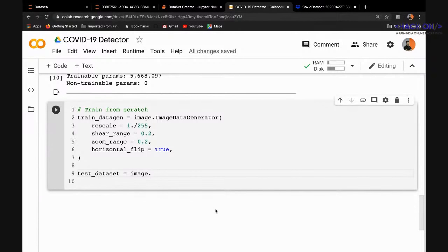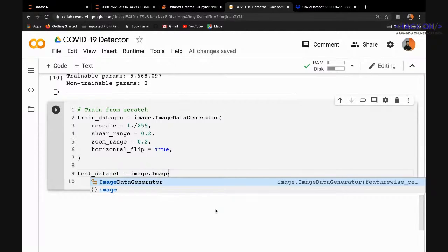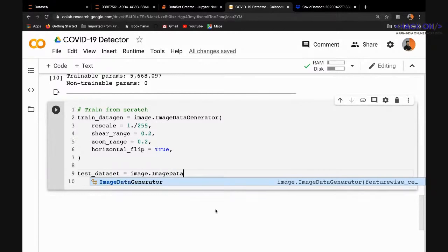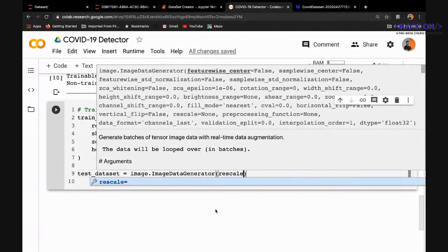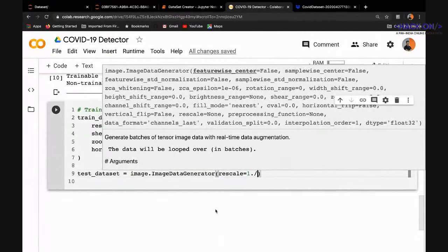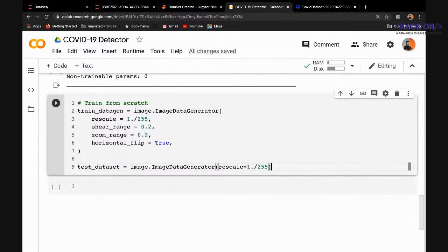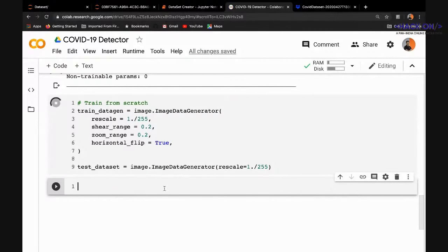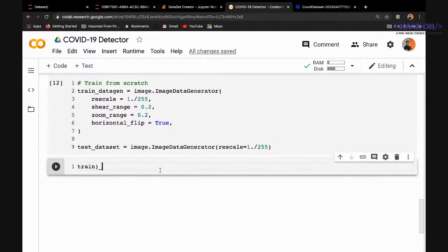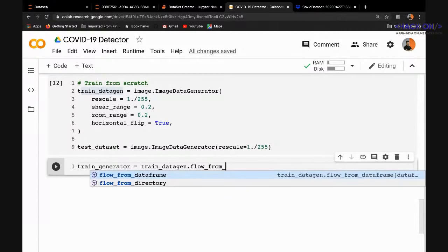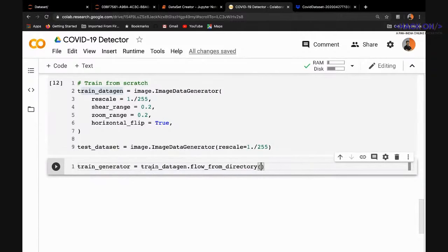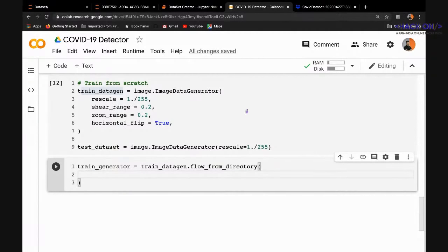For the test data we only do rescaling — no augmentation. We have a train data generator and a test data generator. To create the actual generator function, we call the flow_from_directory method on the generator object.